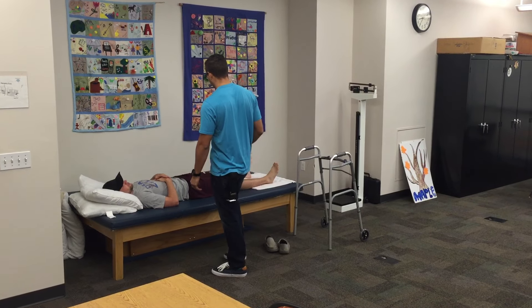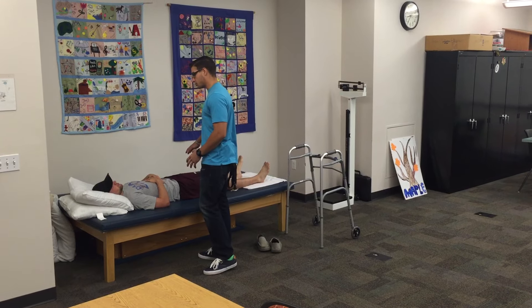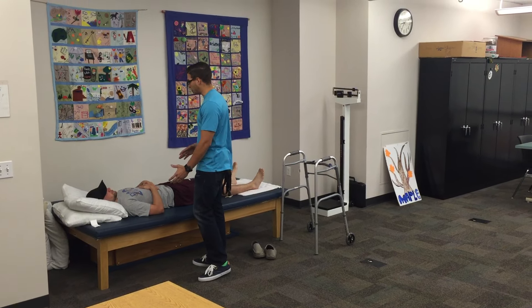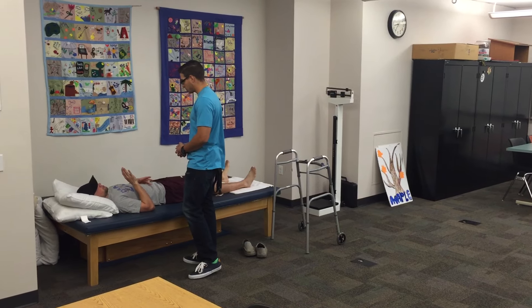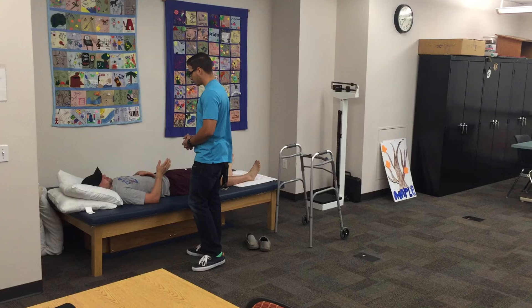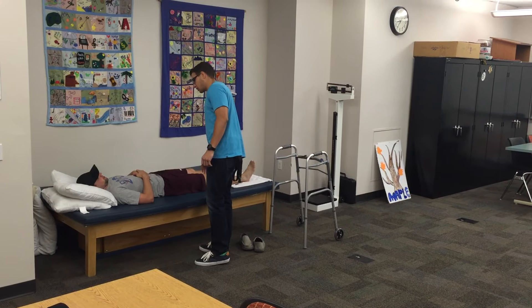So we did have a left hip replacement. There are going to be a couple of precautions with that that the doctor told you. Do you remember any of those? Yeah, the first one was don't bring your leg up, and the second one was don't bring your leg in, and the third one... Okay, can you show me here with this right leg?